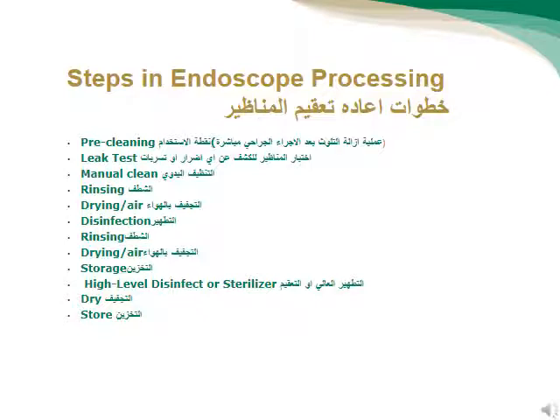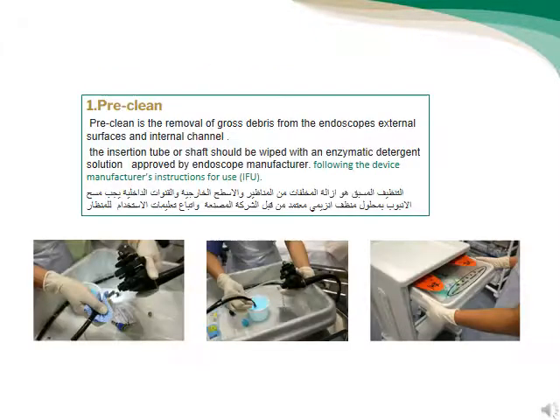Steps in endoscopy processing: Pre-cleaning, Leak test, Manual cleaning, Rinsing, Drying, Disinfection, Rinsing, Drying, Storage. Pre-cleaning is the removal of gross soil from the endoscope's external surface and internal channels using an enzymatic detergent, following manufacturer instructions.